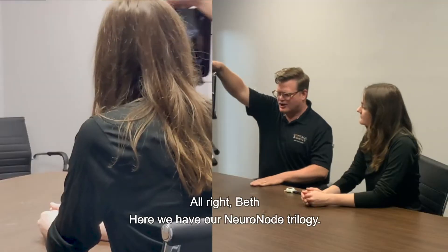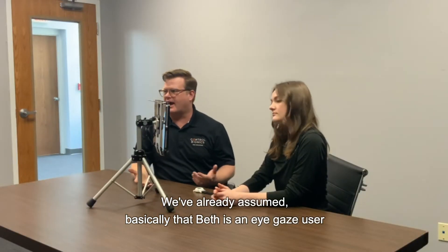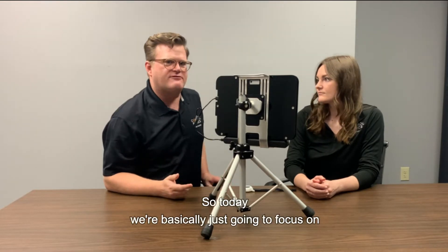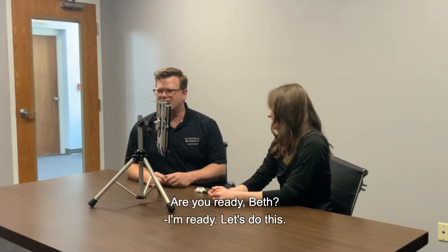All right, Beth. Here we have our NeuroNode Trilogy. We've already assumed that Beth is an EyeGaze user, set up and calibrated and ready to go. So today we're basically just going to focus on getting her NeuroNode to use with the EyeGaze. All right, let's do this.